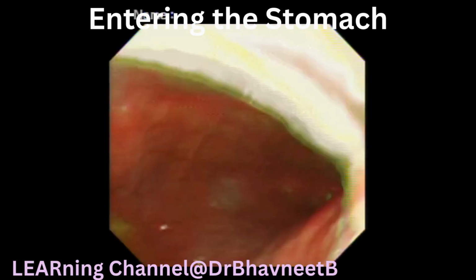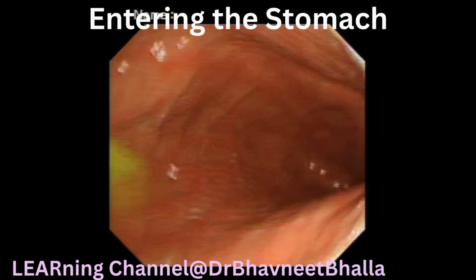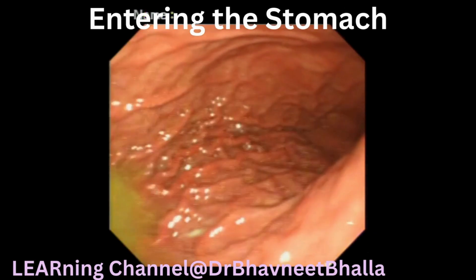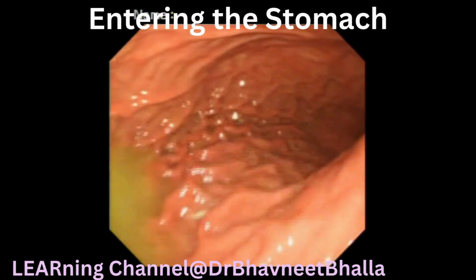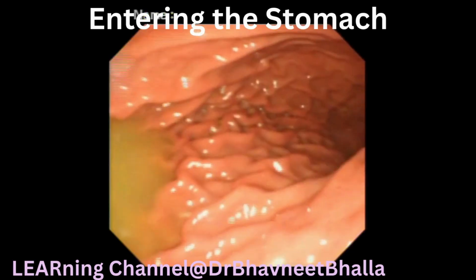Cross the GE junction to enter the stomach. Insufflate to open up the gastric lumen. The scope is maintained in the center of lumen and advanced under vision. The direction of angulation and advancement should be forwards, gently going towards right, and then slight up angulation in the distal stomach to see the pylorus.